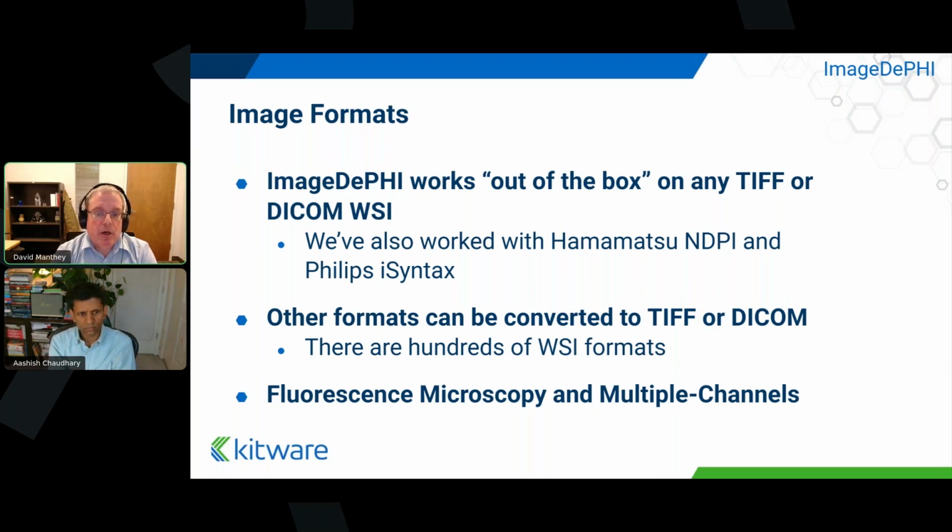So this is something where converting it could be acceptable, but converting it does change data to some degree. It ideally doesn't change your image data in any manner, but you might lose metadata that you cared about. And so that conversion is not always the right choice. If you had to redact a Nikon or CZI file, we certainly could develop techniques for doing that.